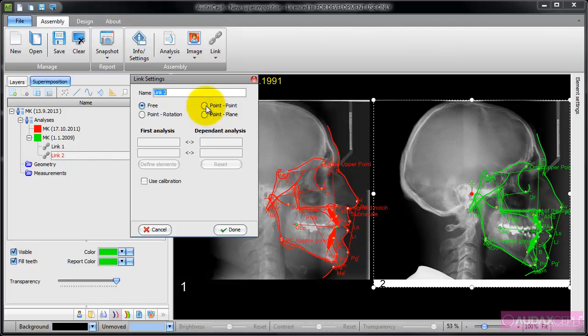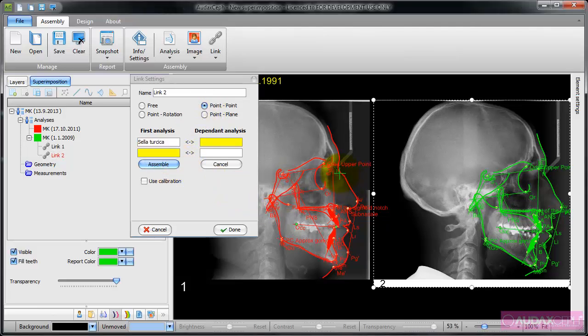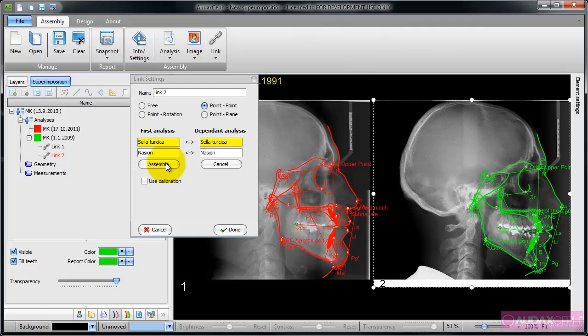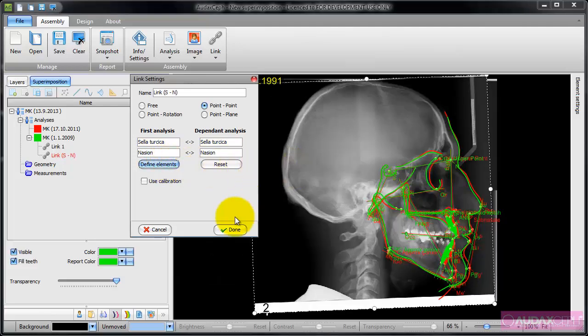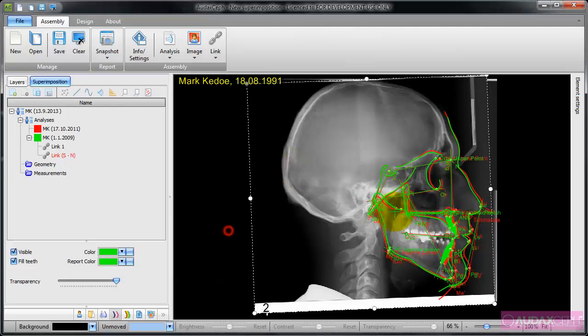First I'm going to align Sella and Nasion of both analyses, so I'm going to choose point and point and define elements. So Sella here in the first analysis, Sella on the second, and Nasion on the second analysis. Now I'm going to assemble it one on top of the other.